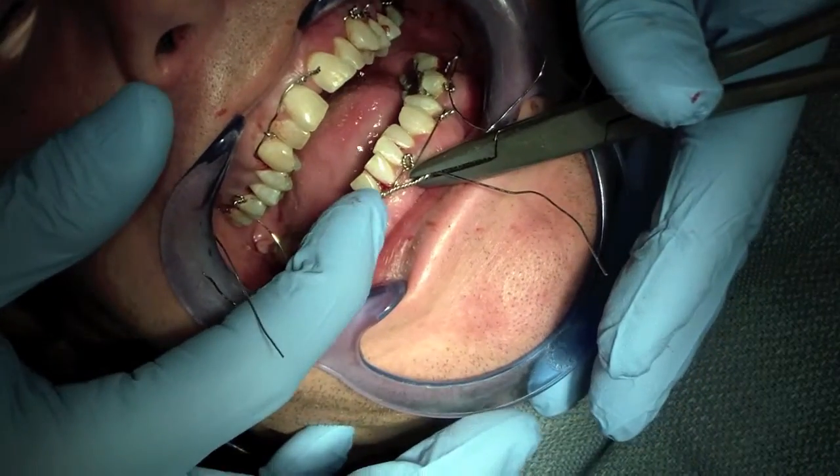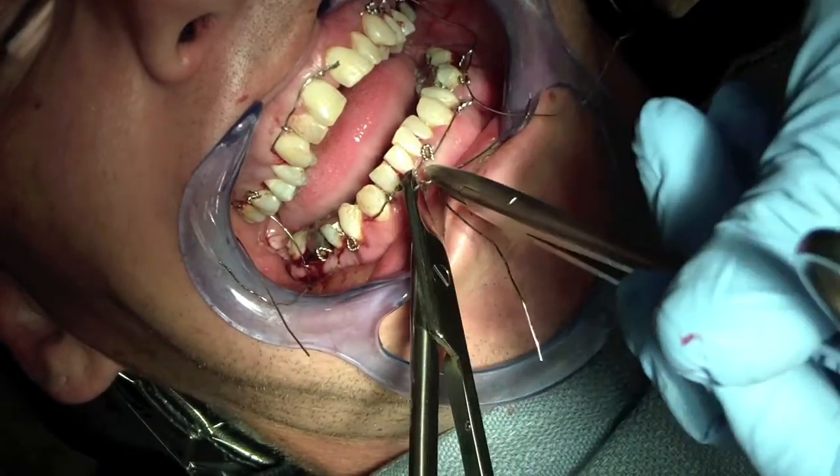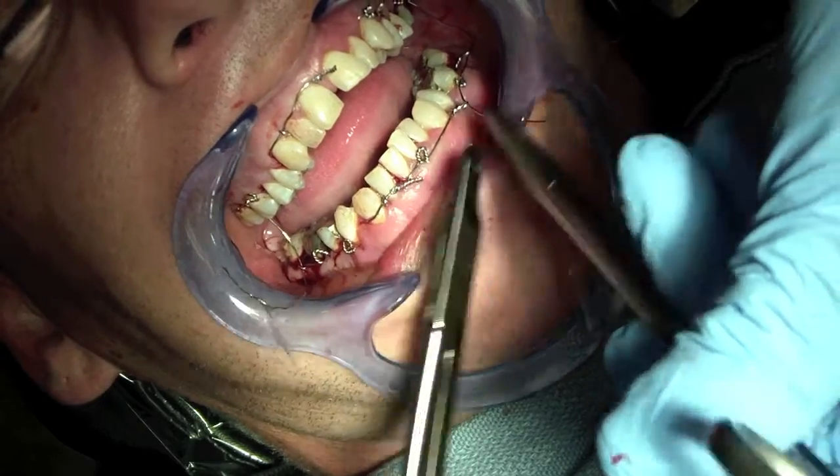Then we're going to clip, and like I said, I'm not going to show it here, but you want to take this wire and use a pickle fork to finish it off. I'll show you in another video.